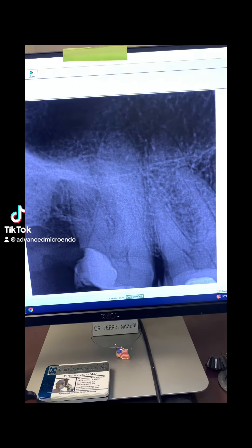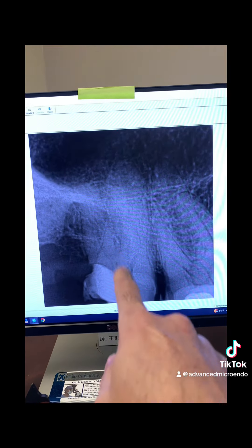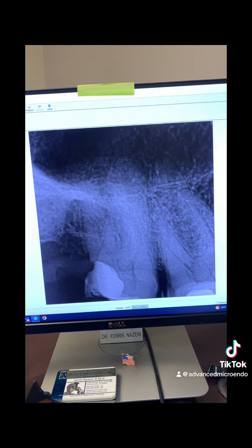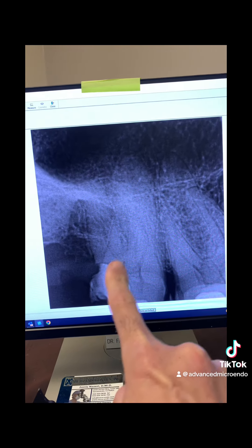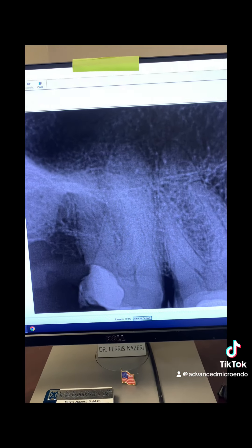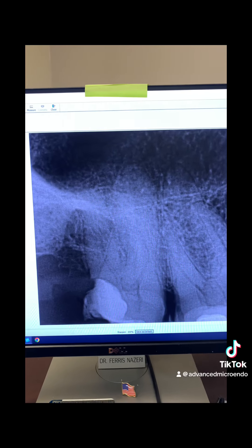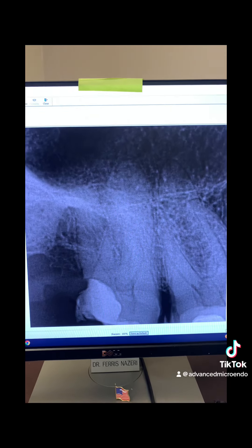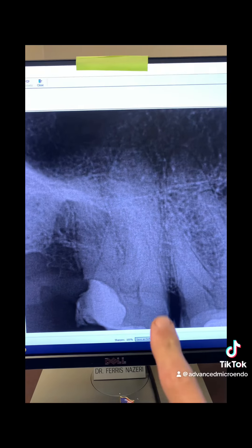This 77-year-old patient was referred to me for endodontic treatment of tooth number two, upper right second molar. The tooth had a big cavity in it, as you can see, and according to the dentist, near pulp exposure. The tooth was prepped for a crown, so there's a temporary crown in the tooth, and the patient was referred to me for endodontic treatment — and that's what we did today.